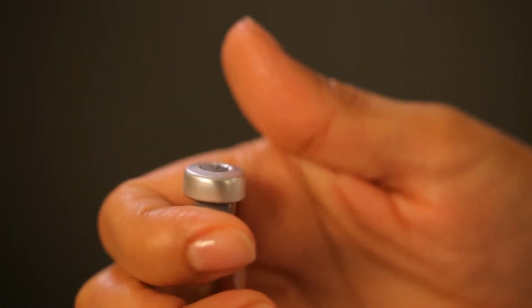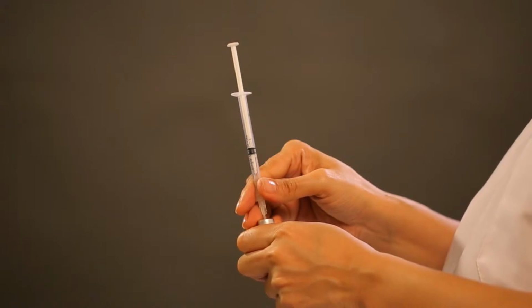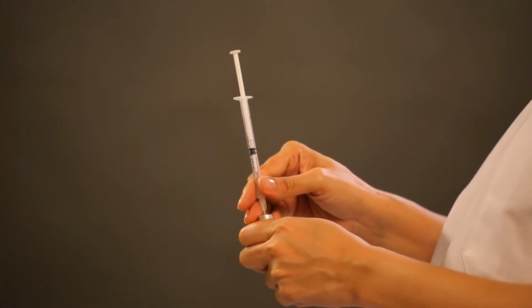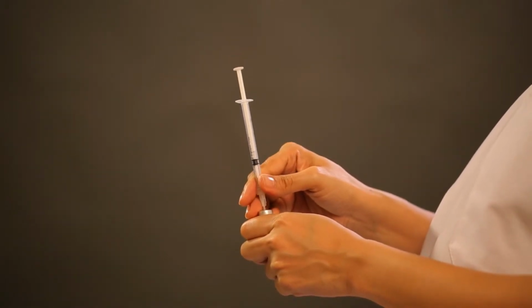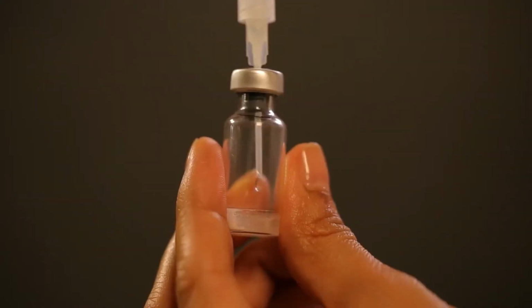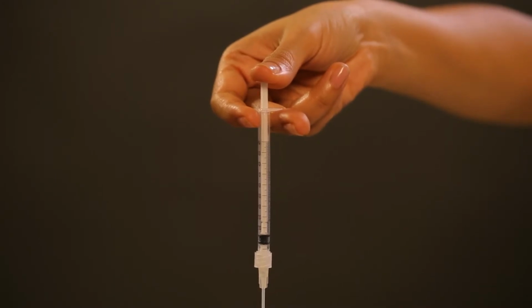Snap off the vaccine vial flip top. Pierce the stopper of the vial with the needle and push in the syringe containing the diluent into the vaccine vial. Allow the diluent to be drawn into the vial. Push the plunger if required. Ensure that the entire syringe has been emptied.